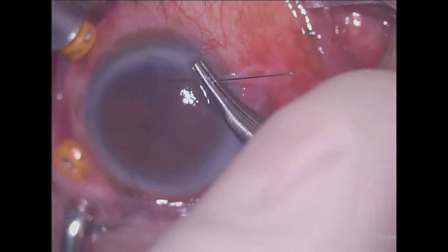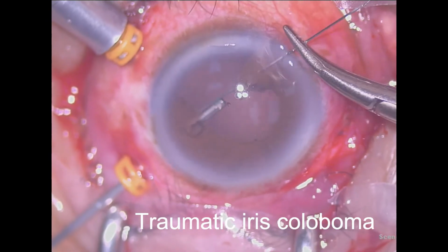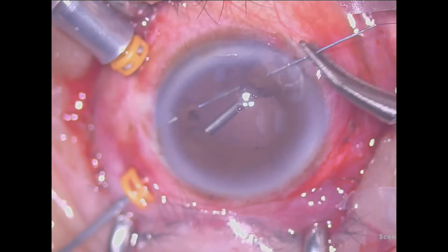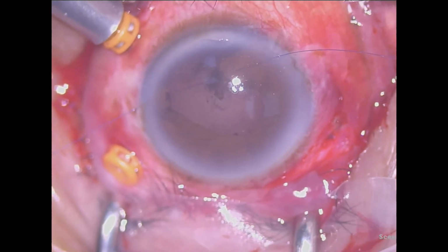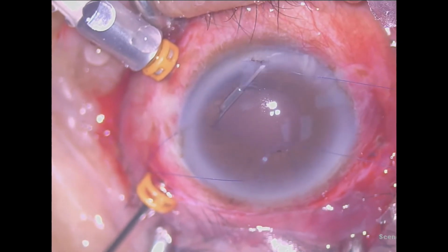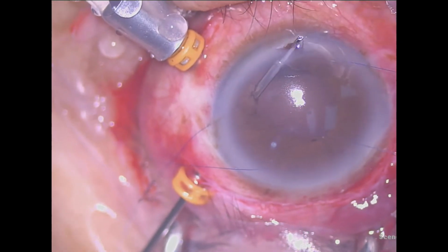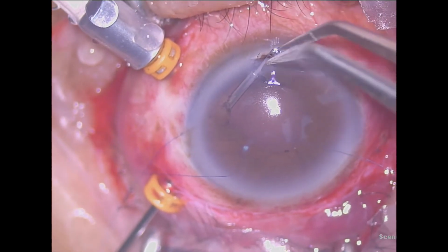Here, we perform 23 gauge vitrectomy and lens fragmentation. Then, we perform iridoplasty and Prolene 9-0 suture is used. The needle passes across the sphincter to sphincter through the cornea. End suture is pulled out using forceps and modified hook, which I make myself by bending the tip of the instrument into half rounded to facilitate the retrieving of suture.